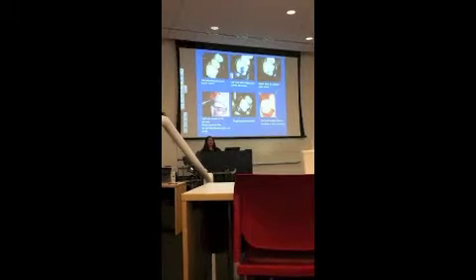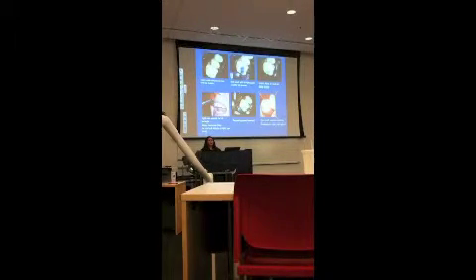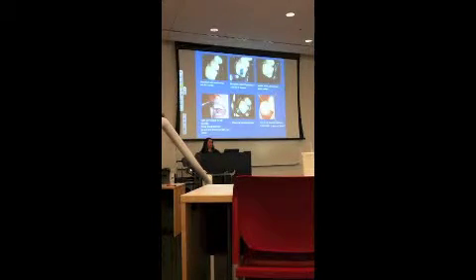And then, lastly, you want to check your occlusion to make sure that the patient isn't biting too high. And if we have a high spot, then it can be adjusted with a low speed handpiece and a burr or a disc. Okay?